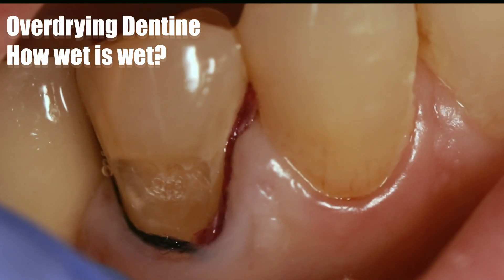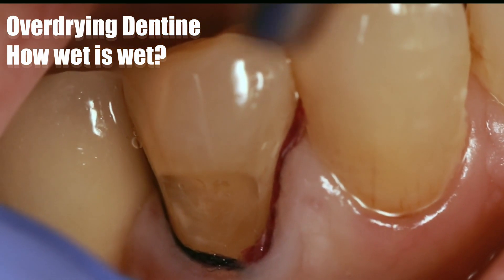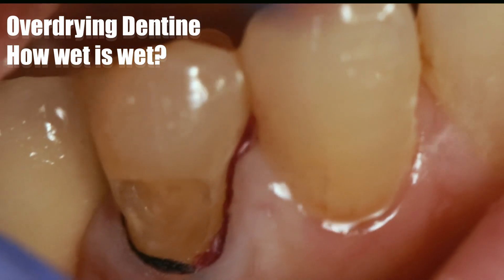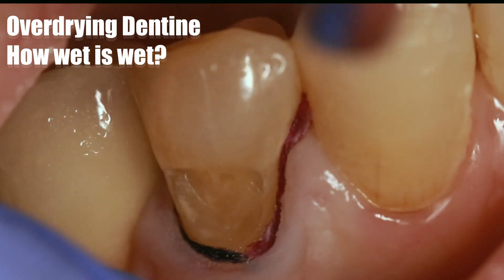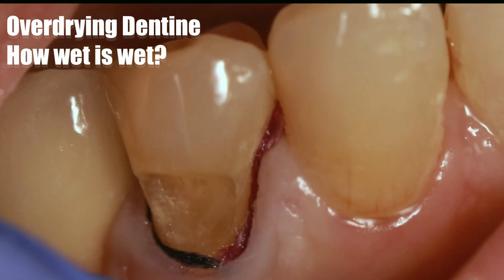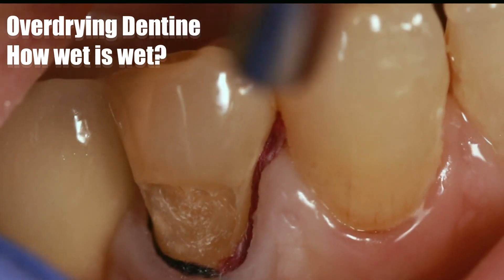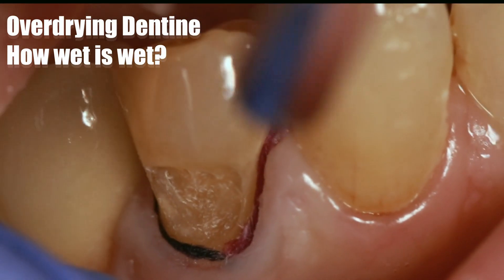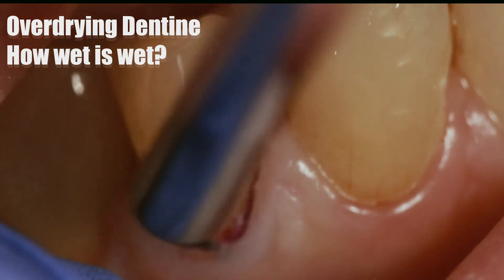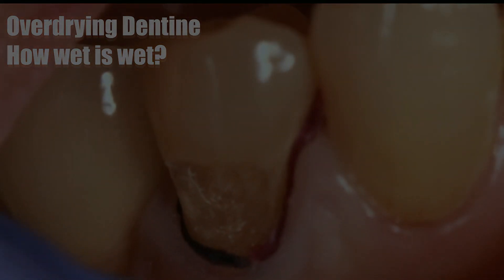If we put water back again, you can notice that this structure disappears. You keep on drying until pooling water is no longer present — this is the right moment to stop. Past this point, it's no longer drying of dentin but rather desiccation of dentin, causing further collapse of the collagen network.